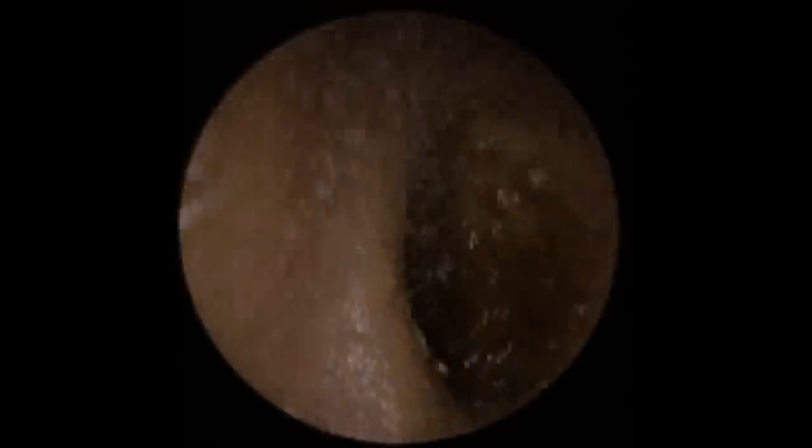This is the patient's second ear. Like I said, not really having any difficulty with the hearing, but more of an irritation on that side, so the patient asked if we could remove this wax and we said we would. You can see where the outer section — they've been using a bit of oil on this one as well — has just kind of more liquefied the wax; it's turned more of a mush. And then you've got this harder, smoother section a bit further in.